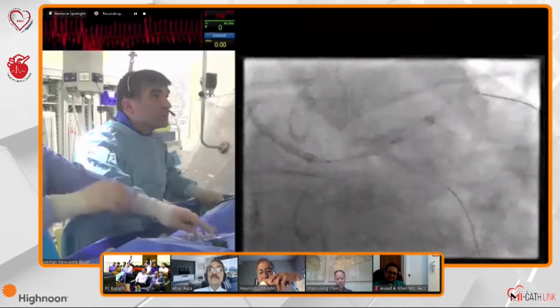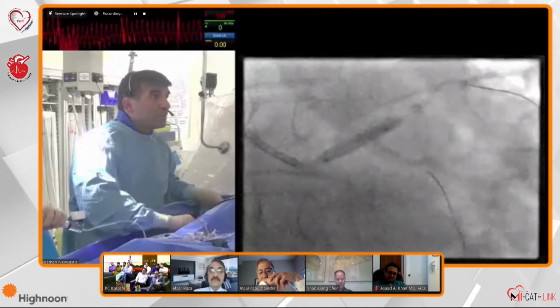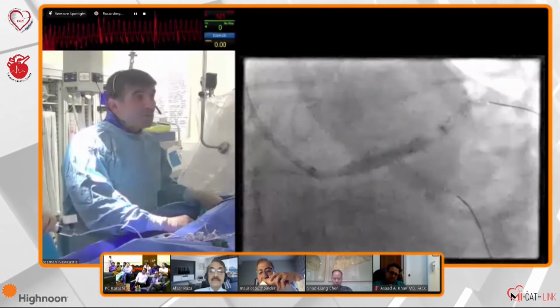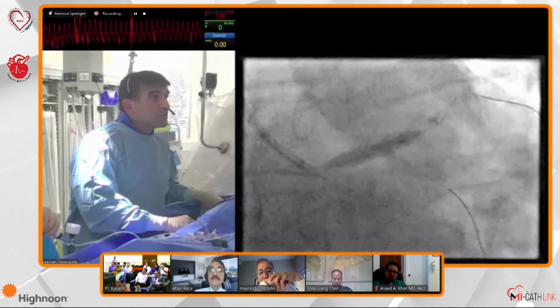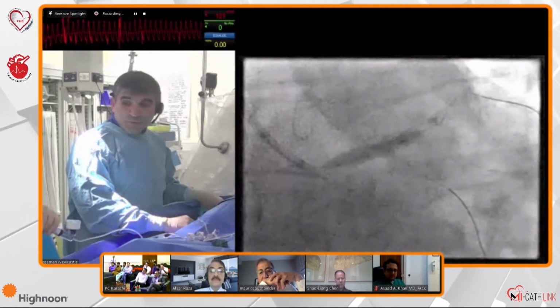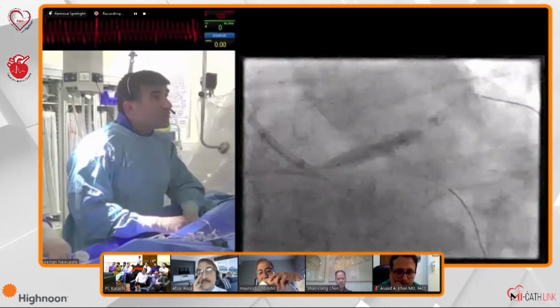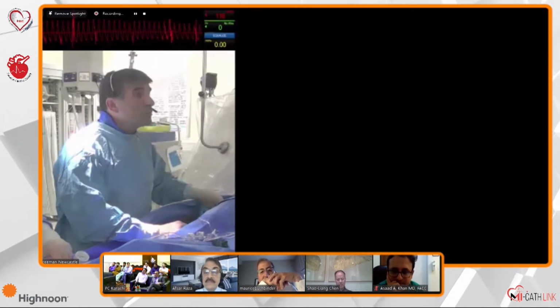Okay, go up there. Go up to 8. Highest you can. 10. So it's like a T stenting. It is a T-stent. 12. That's proper T. And down. I'm going to bring this to the left main and go a little bit higher to 16, and I think we'll be done by that, and do the IVUS run and we'll be done.